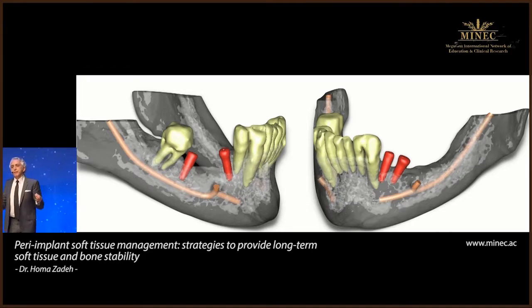I discovered that randomly in one of my patients, except I didn't recognize it at the time. This is one of my patients who presented. Unfortunately, I did not place these implants. These implants were placed by another colleague, and because of the angulation, they were really non-restorable.